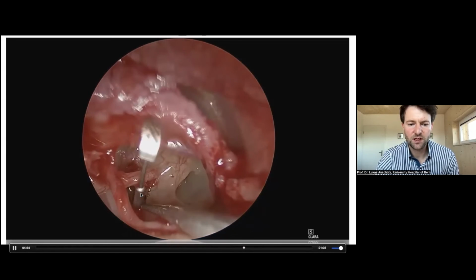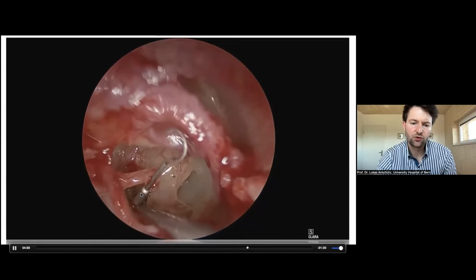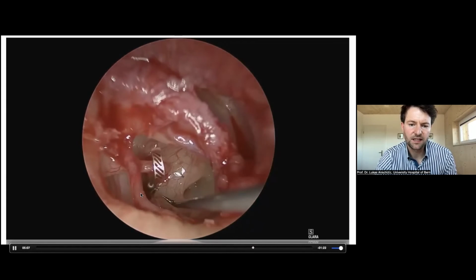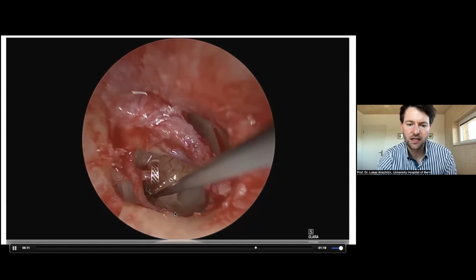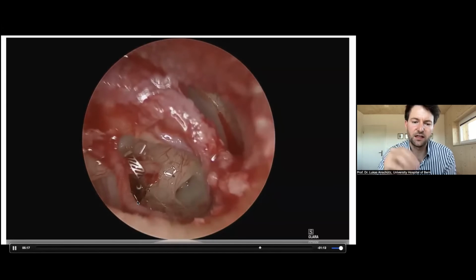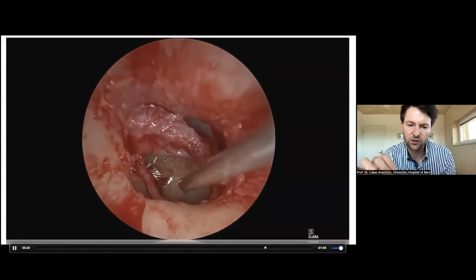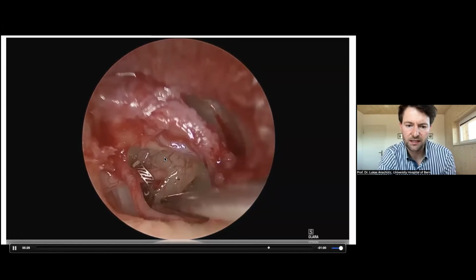Now the positioning of the stapes prosthesis with one hand probably is a bit more difficult. And I usually don't put it in with a forceps, but I just position it somewhere. And then with the needle or with a hook, I can push it gently to let it fall in. You saw just now it fell in the hole and is now attached to the long process of the incus. I think it's very important not to push on the footplate while you try to put inside the prosthesis.